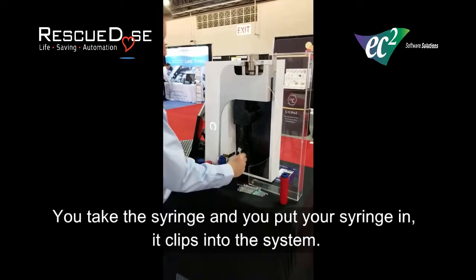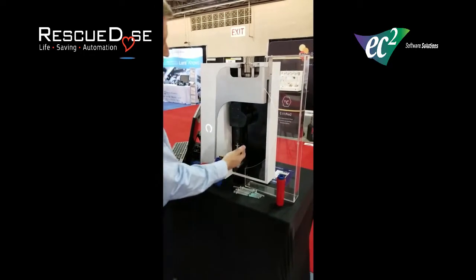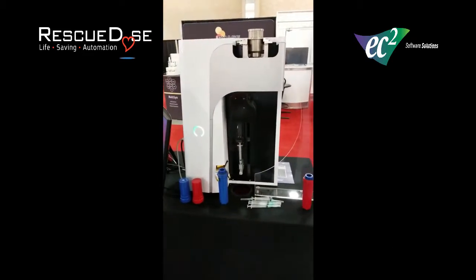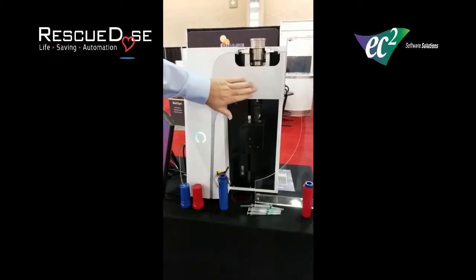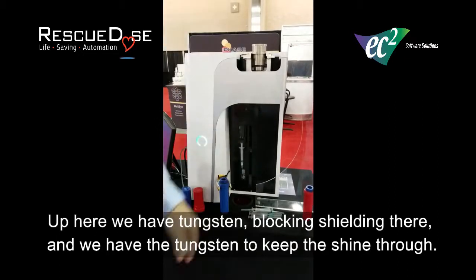You take your syringe and put it in. The system clips into the system, pre-labeled, and then you can go ahead and put it in. I'm going to tell the machine to draw half a mil. It's going to go up, draw its activity. Up here we have tungsten blocking, shielding there, and tungsten to keep the shine through.